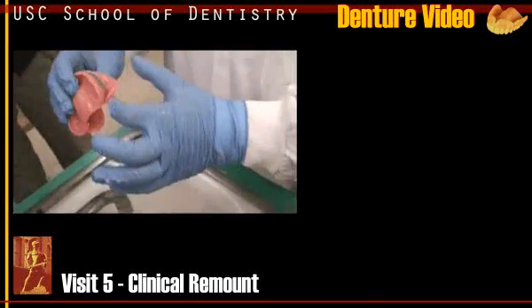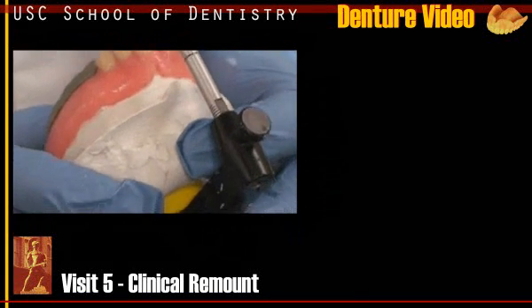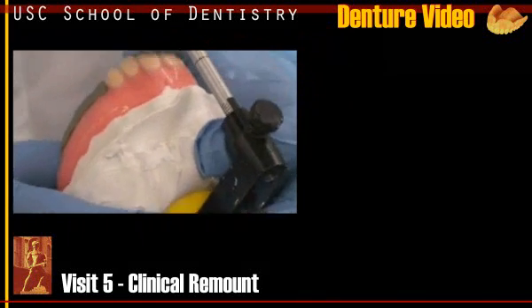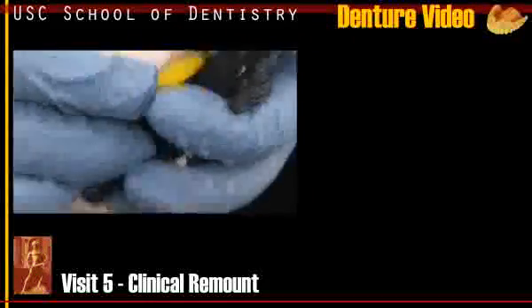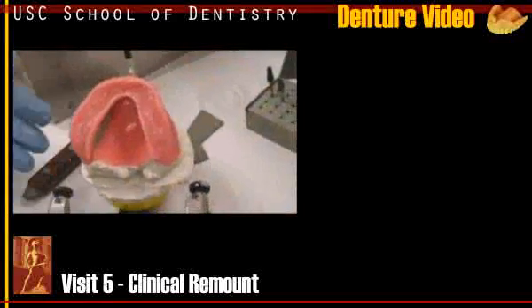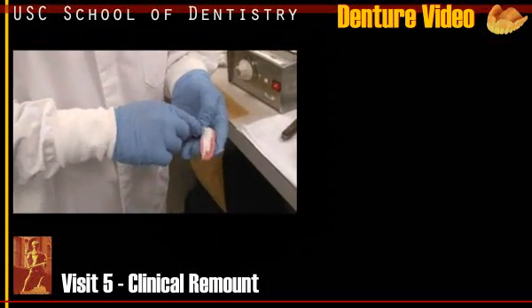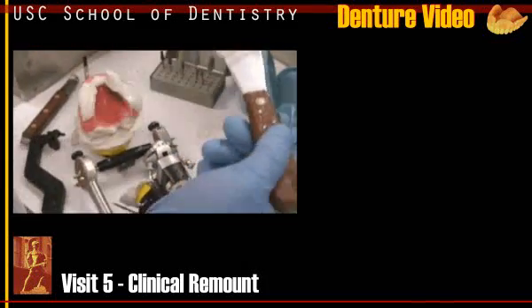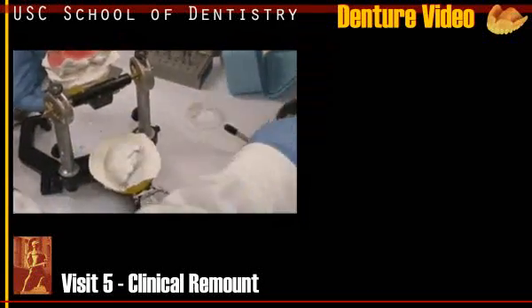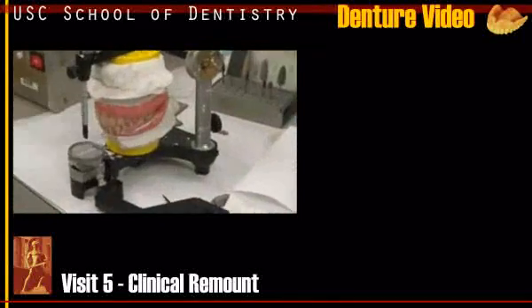Nothing touches it, only this, nothing touches, right? This is not the right position, right? Why is that? Okay. There. This is the right position, right? That's flush. So that area needs to be flushed. You can see it. So put it in here. Block out the undercut, so it's easy to take it out later. Pin is always up, okay?